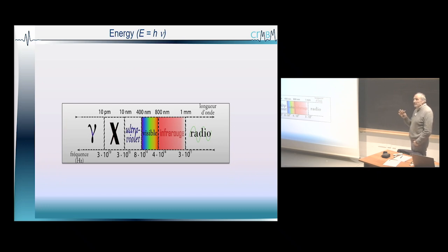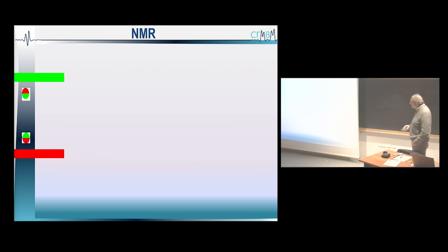We can repeat the NMR experiment several times, it's okay, but you cannot do several X-rays in the same days or every day, because it will be harmful. So NMR is not aggressive, but is not sensitive. So you need to deal with that.